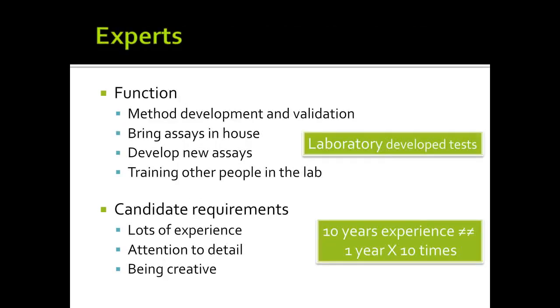How about experts? The expert level needs to know how to do method development and validation, how to bring assays in-house, develop new assays in-house, and also train other people in the lab. This is all around basic laboratory developed tests. And also, set up protocols so people avoid common issues, and all of that can enter the expert arena. The candidates require a lot of experience, a lot of attention to detail, and need to be creative. So those are not really easy to find.